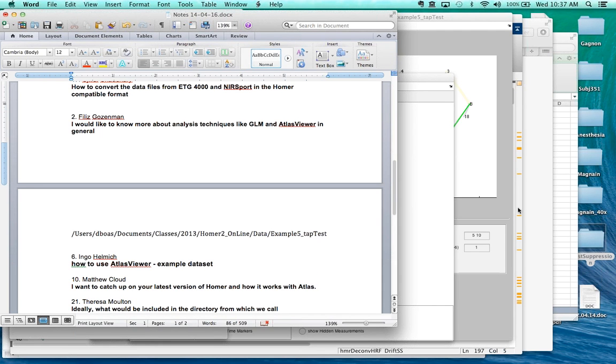Okay, Amanda just put a question up on the chat. Back to my question about different subjects and channels. Since we're using the same processing stream parameters for all, does it matter which file and channel you start with and use as a basis for the rest of the group?